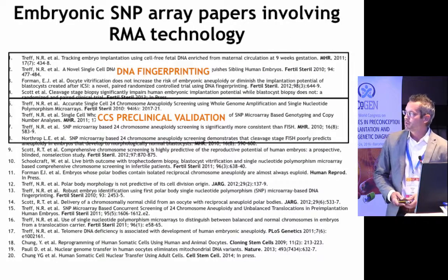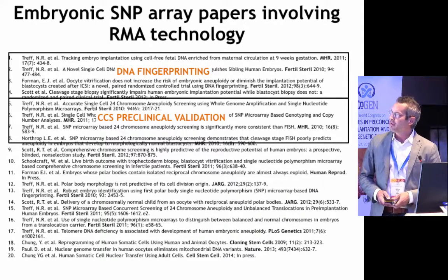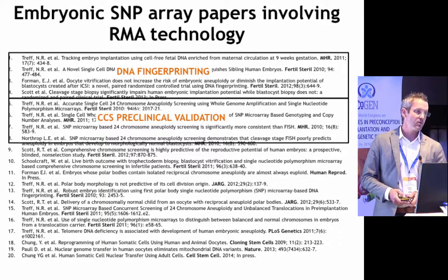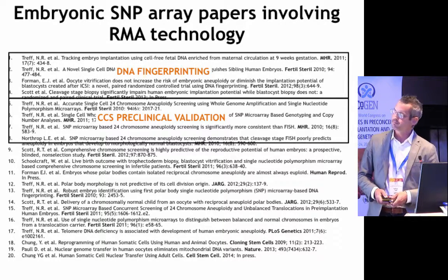In my lab, we've done quite a bit of validation of this technology before clinical application. Some of the publications are shown here. And initially, we developed this so we could fingerprint embryos when you transfer 2 and 1 implants, and you can determine which one it was, so then you can go back and ask whether or not there were differences amongst the embryos that could have been used to select that particular one with reproductive potential.